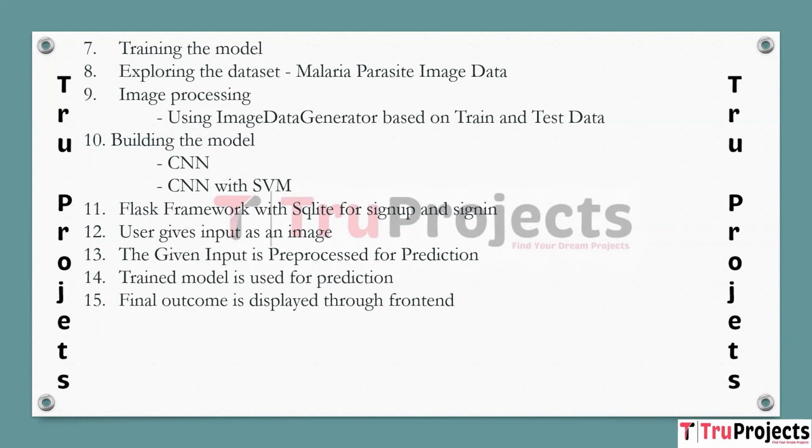The result of the prediction indicating the presence or absence of the malaria parasites is presented to the user through the web application's user interface.